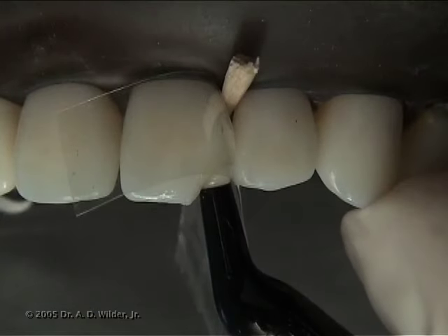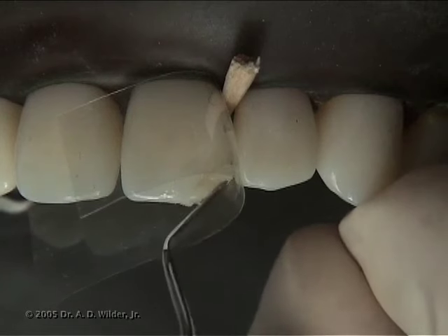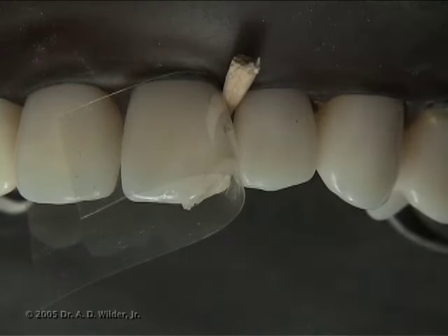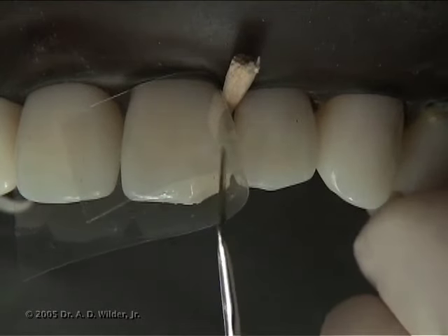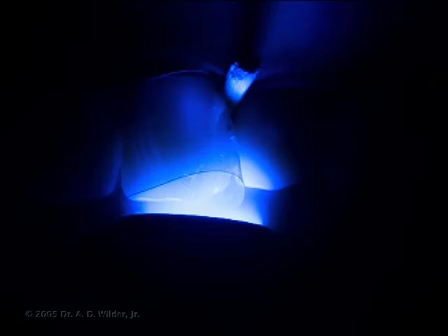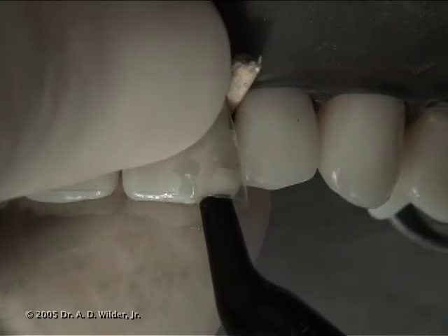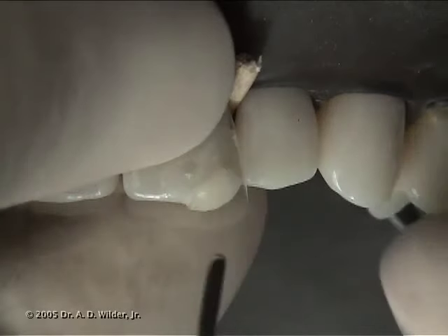Add more composite to continue to rebuild the missing tooth structure. You can dip the end of the instrument in a little bit of adhesive to prevent the composite from sticking to the instrument during this process. As you get closer to the missing incisal corner, be sure to hold the matrix strip in place with two fingers of your non-dominant hand, but also don't pull the matrix too tight, which will result in an under-contoured final restoration.